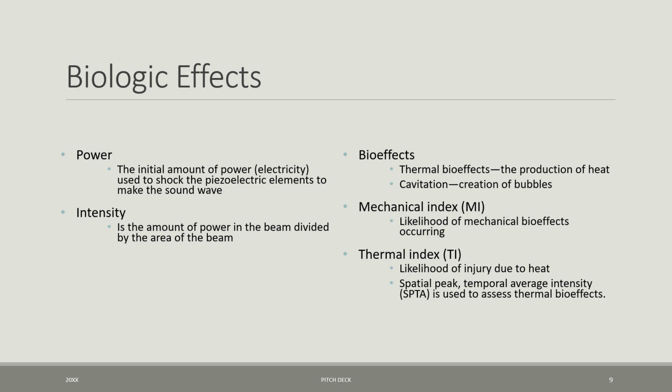The first thing is power. Power is the initial amount of electricity that's going to go to stimulate those piezoelectric elements to produce a sound wave. So the higher my power coming in, the higher my voltage amplitude will be. The higher the voltage amplitude, when it reacts with that piezoelectric element, that element will then produce a sound wave mimicking that voltage. So if I crank up my power, I'm also cranking up the amplitude of my sound wave. And as I do this, I have more intensity in that sound wave.